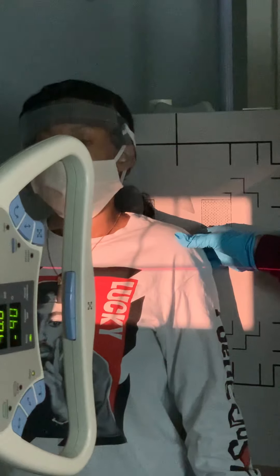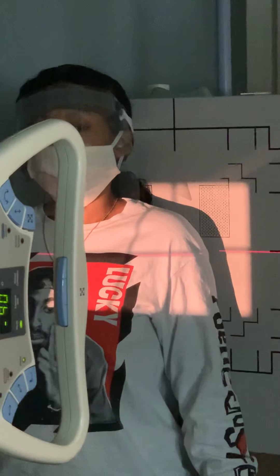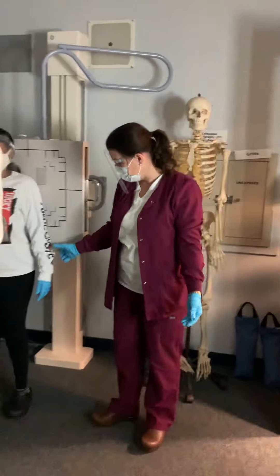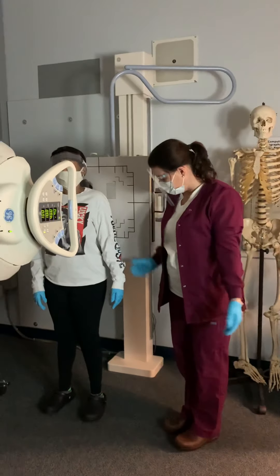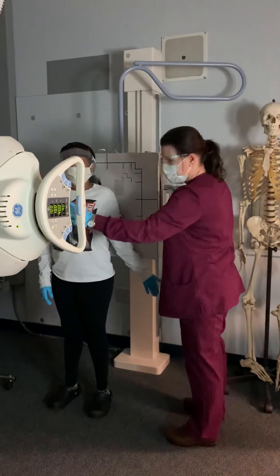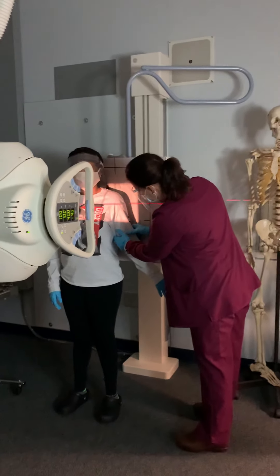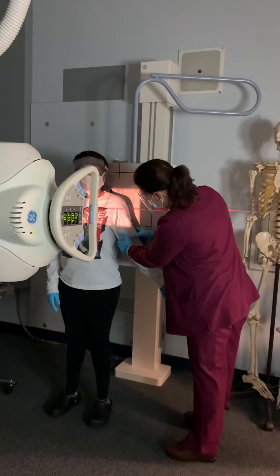Shoulders over the center chamber. I'm going to do the AP external rotation first. Take your arm and turn your hand out — there you go — on the back of your arm, all the way up against my board. I'm going to bring your arm out just a little bit, away from your body.